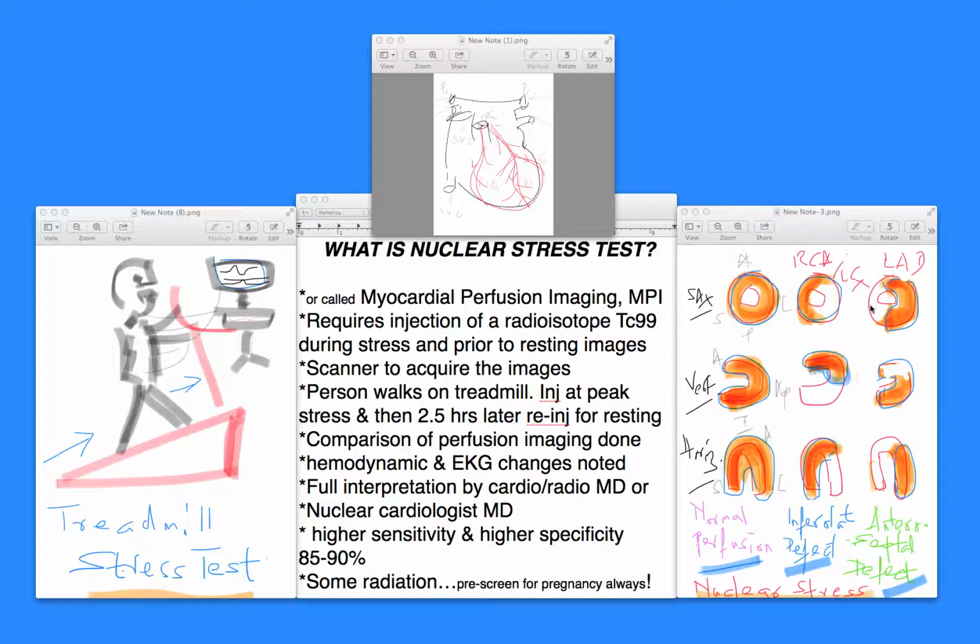So here it's supplying the septal wall there, which is very important because that's where the entire bundle branches are going. This is your anterior wall, you can see that. And here's your septal and apical, because LAD runs almost to the apex. So it'll involve the apical as well.